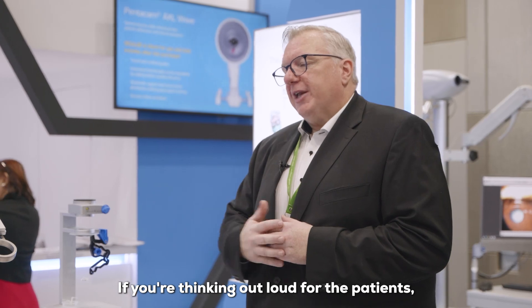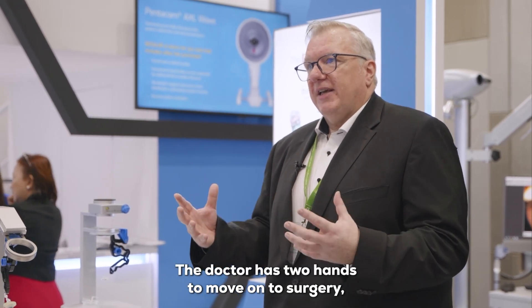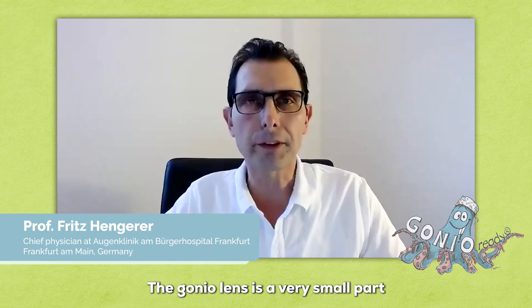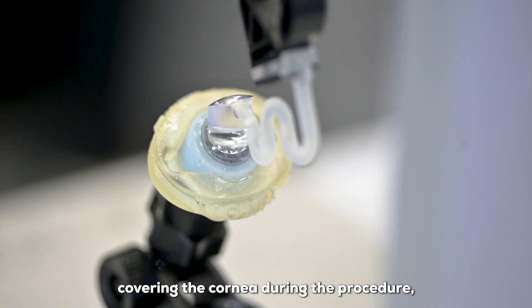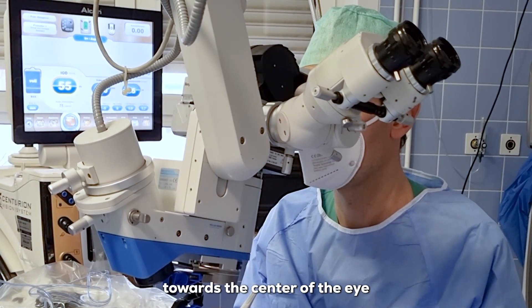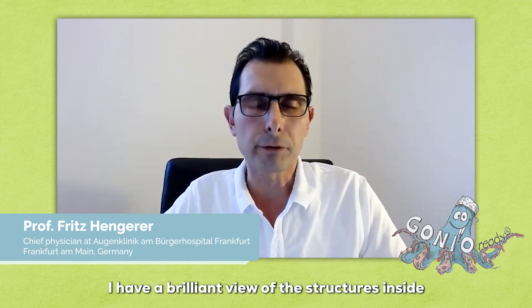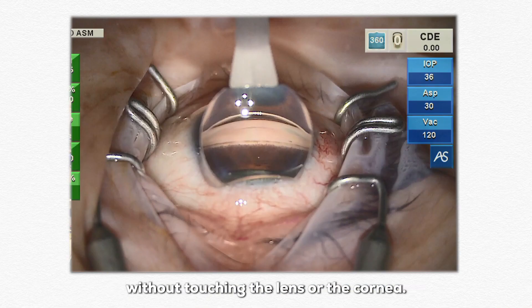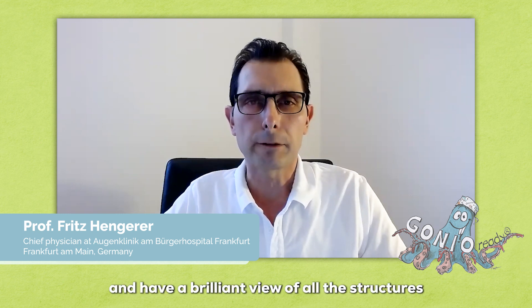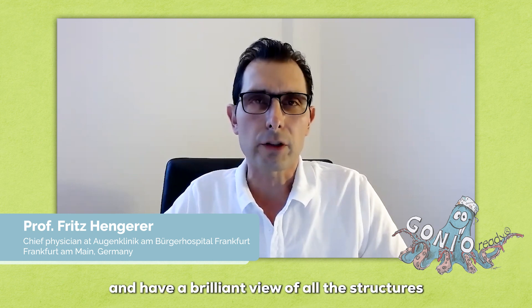Thinking about benefits for patients, it comes down to one word: safety. The doctor has two hands free during surgery, and that's the big thing. The GONIO lens covers only a very small part of the cornea during the procedure, meaning the surgeon has access through the microscope view toward the center of the eye. When entering with devices into the anterior chamber, there is a brilliant view of the structures inside without touching the lens or the cornea, and then further viewing the chamber angle with the microscope provides a brilliant view of all the structures to be accessed.